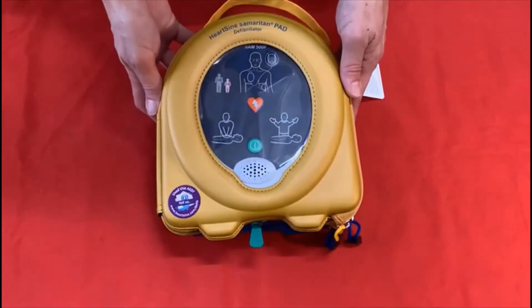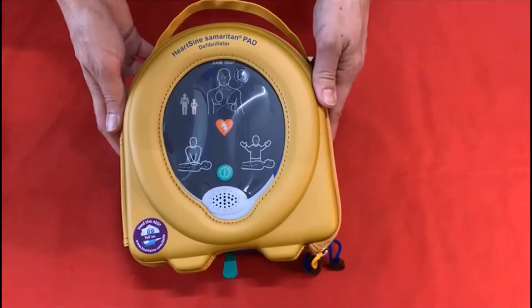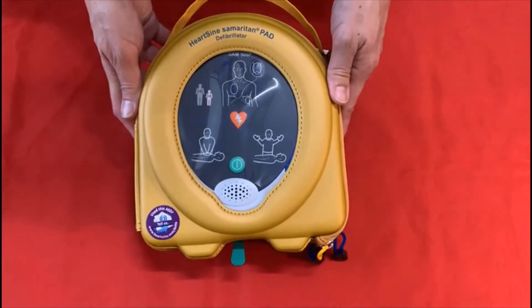Julia from Response4Life showing you how to replace the pads and battery on your HeartSine Samaritan 500P defibrillator.